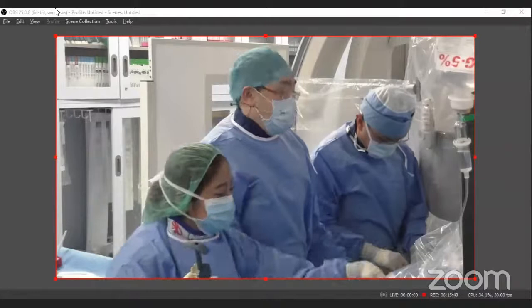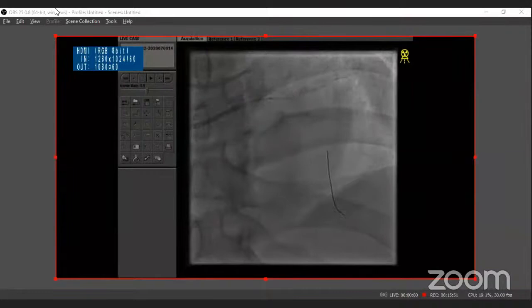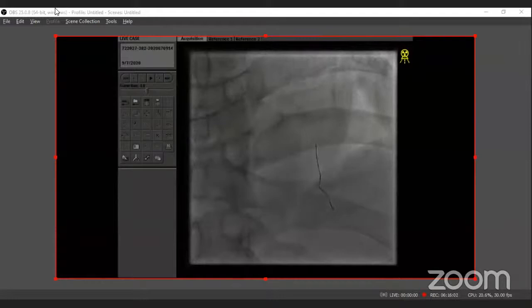So this is a 3.0 by 28. So the wire is a little bit difficult to control. Oh, careful. Okay, it went in smoothly. Okay, the wire goes down. So we want to stent it just before the diagonal. Yeah, smooth. Test.